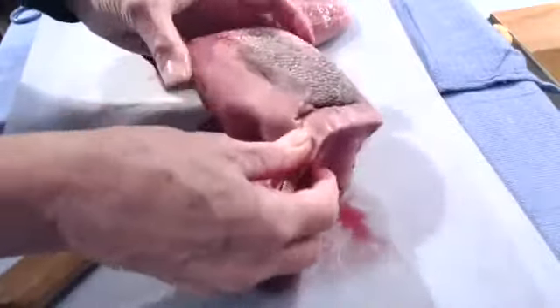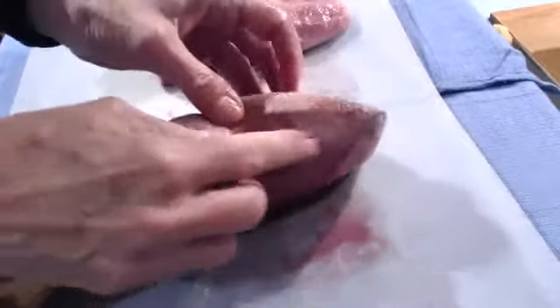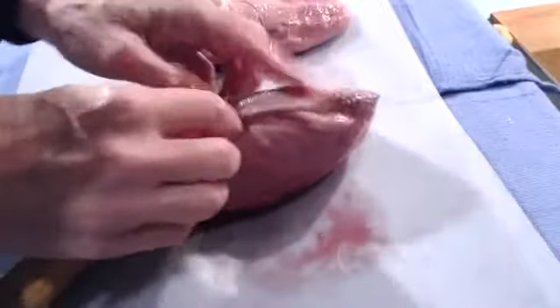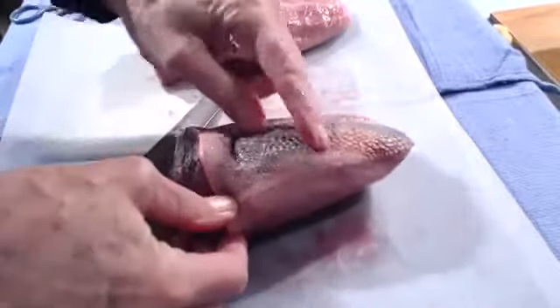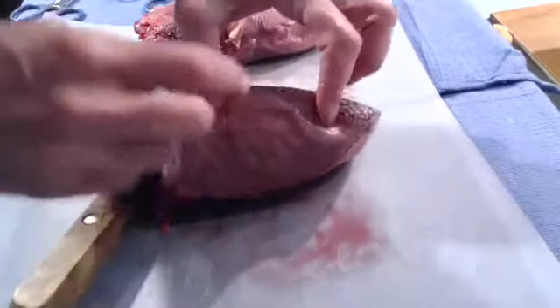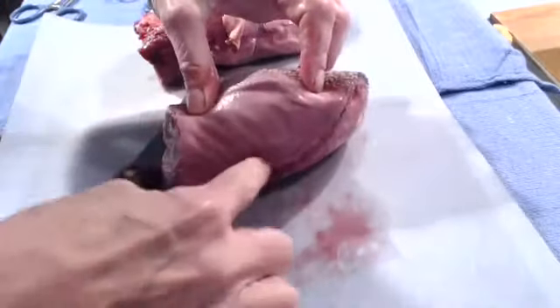For the perineal repair model we want to look at our piece once we've cut it to see which side, this side or this side, would look more like a perineum and I think this side would. I make the taste buds be the vaginal mucosa so if you picture the vulva like this, this is vagina here and then this is perineum with the rectum down here.